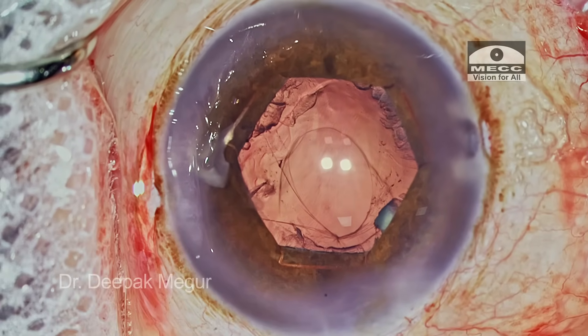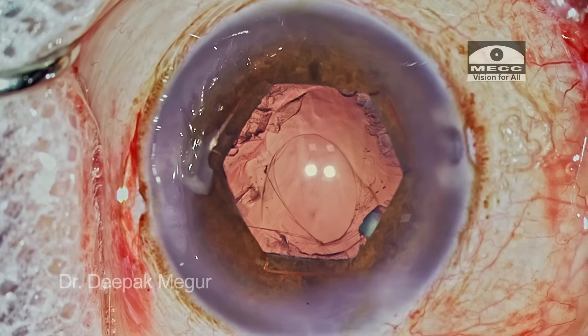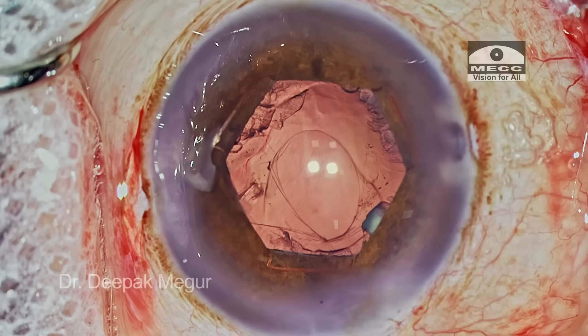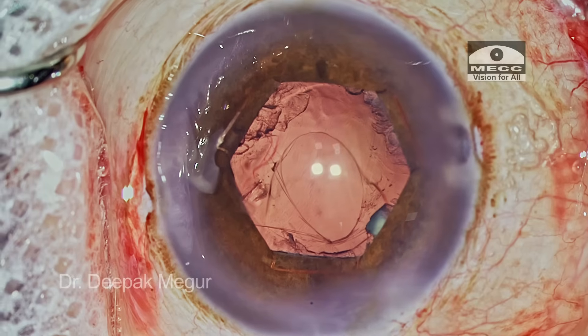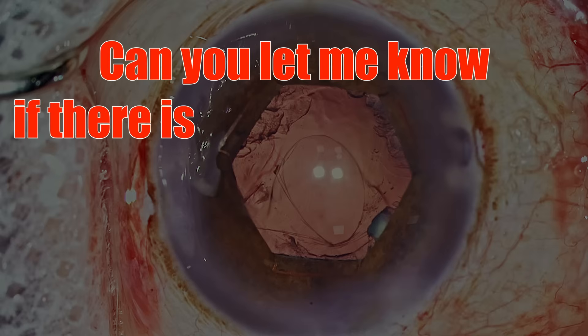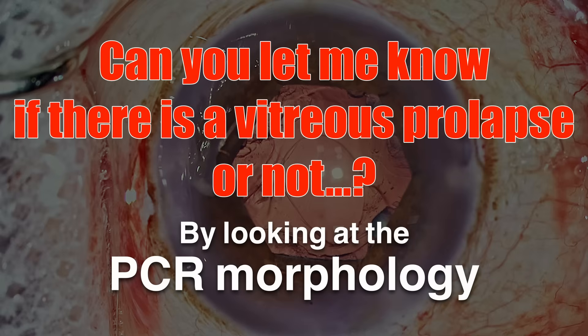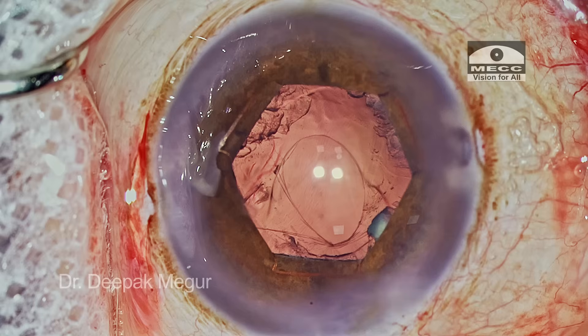Can we tell, looking at the morphology of the PC tear, whether the anterior vitreous is ruptured or intact? Let me pause here. I want you to comment whether there is a vitreous prolapse or not at this stage, and if so, kindly provide an explanation for that.